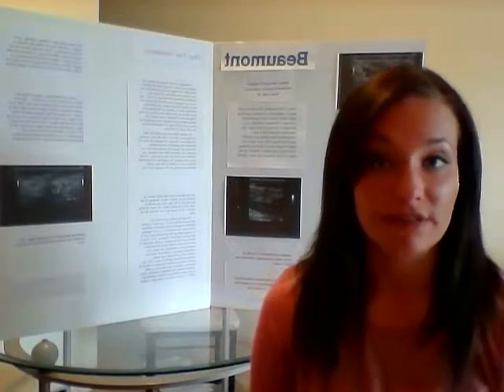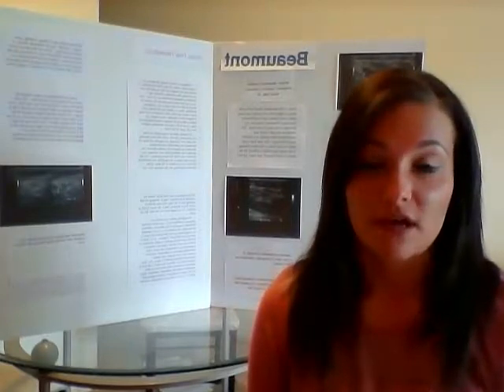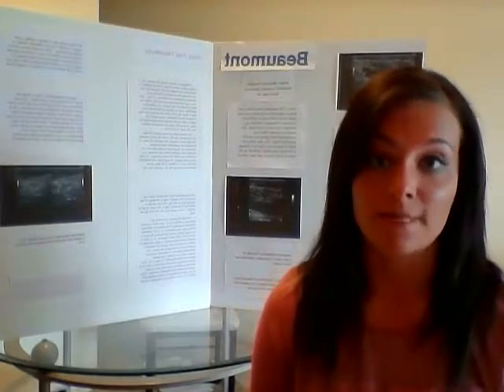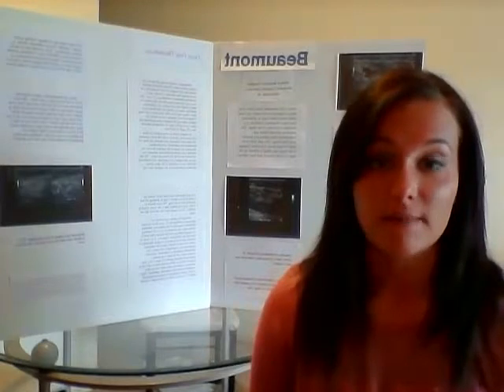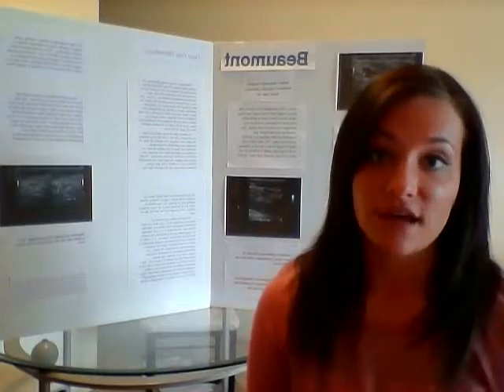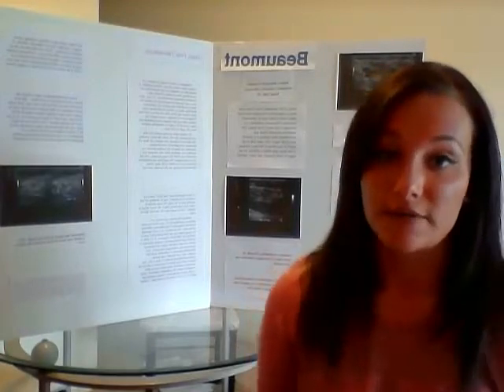But what was cool about this case was in the distal common femoral portion of the vein, you could actually see the thrombus moving. And so we took a lot of cine clips of this, a bunch of images of it, and also B-flow and color flow. We took a bunch of velocities, anything that we could do to notify or show the vascular surgeons that this is very dangerous and that it is potential to break off and cause another pulmonary embolism. So that was my case.